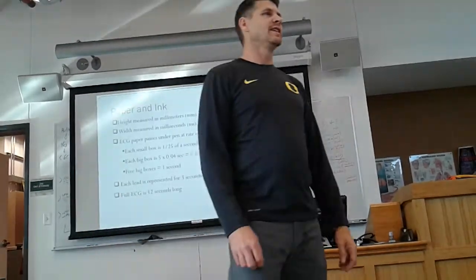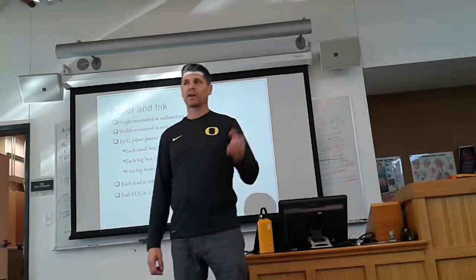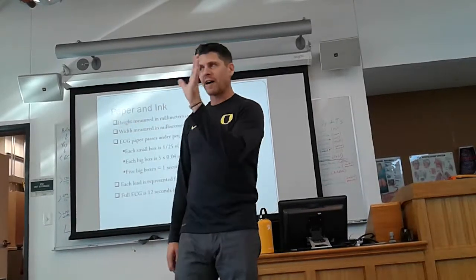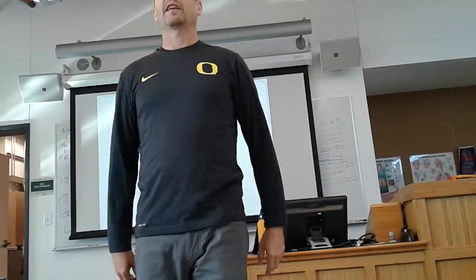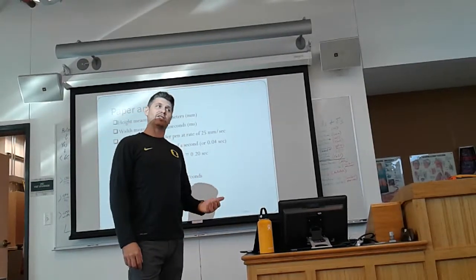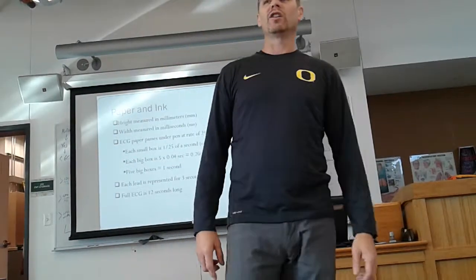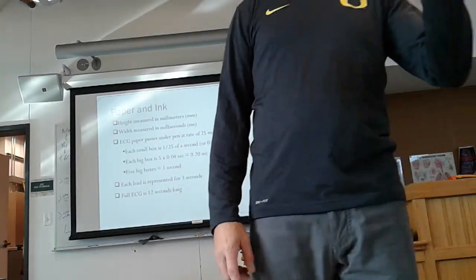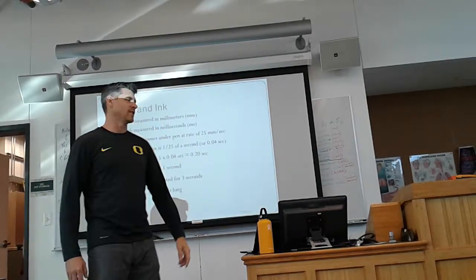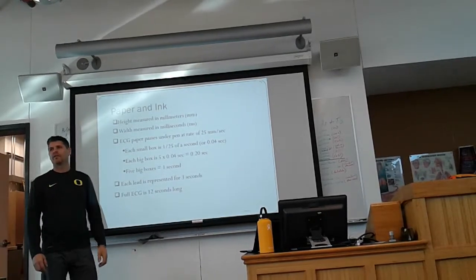There are 5 little boxes per large box from left to right, and it's a square, so north to south also. If there's 0.04 seconds per every little box and 5 little boxes per big box, then how many seconds transpire in a big box? 0.2 seconds, good. And how many 0.2s do you have in one second? 5, so therefore how many large boxes do you have in 1 second? 5, good. How many little boxes do you have in 1 second? 25, good, okay.